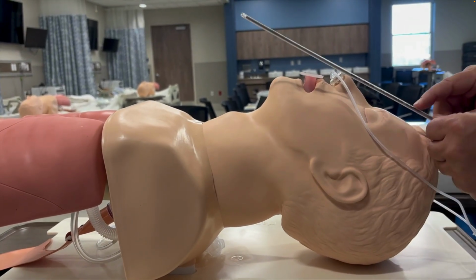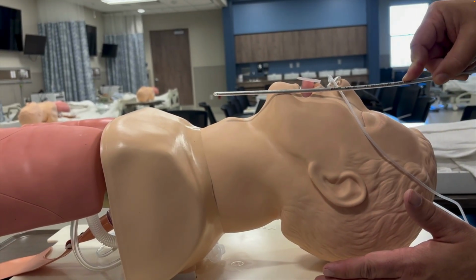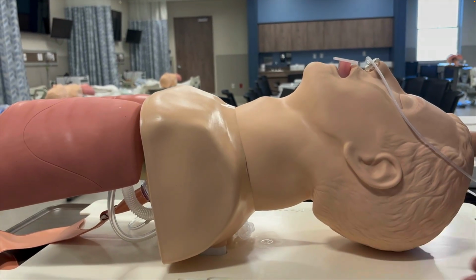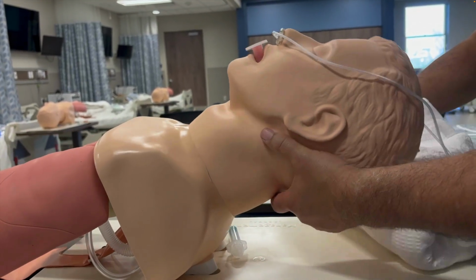And also the facial plane, you notice that the facial plane is also at an angle. We also want that facial plane to be parallel to the floor or to the ceiling. In order to do that, we can use blankets or pillows in order to correctly ramp up the head to create that positioning.